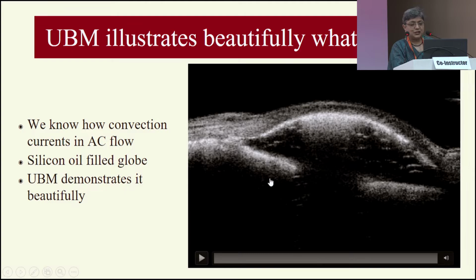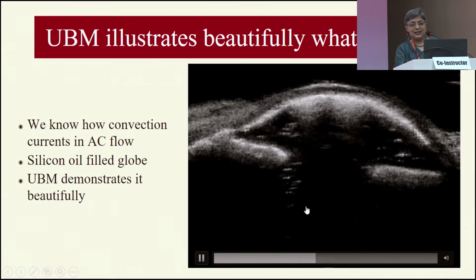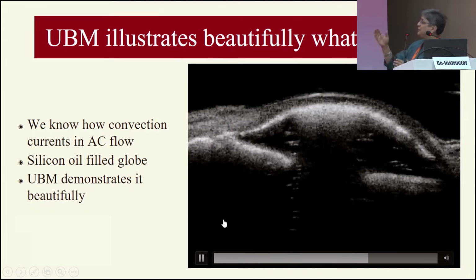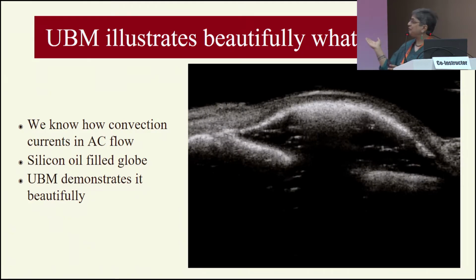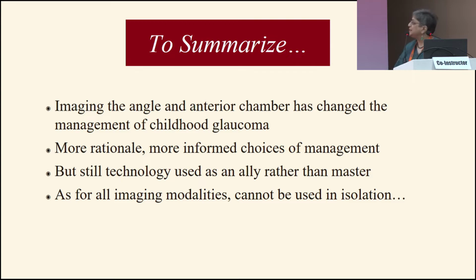Just as a parting shot, this is a child with silicone oil, and this actually is the silicone oil there, and this illustrates beautifully what we know: the convection current of emulsified oil going into the angle, telling us why there is glaucoma in emulsified silicone oil. To summarize, imaging the angle and anterior chamber has changed the management, and more rational, more informed choices of management are possible. But we use technology as an ally, not as the master, and we can't use it in isolation.